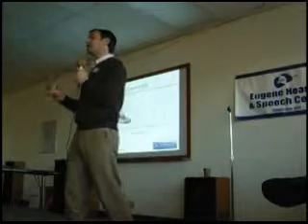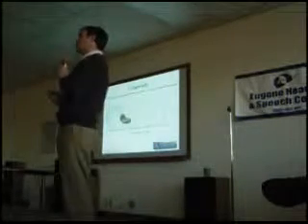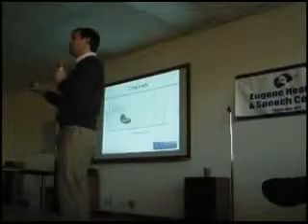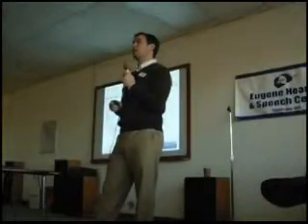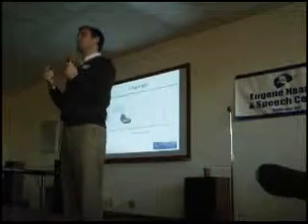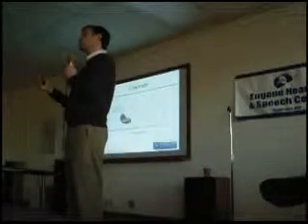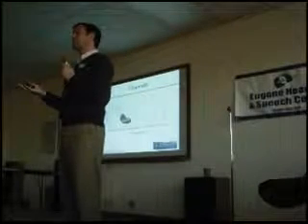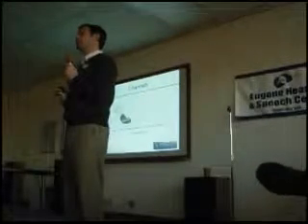Are your needs such that you have to hear in background noise situations, in which case you could say, maybe it's worth going to the hearing aid that can do the job better. And it goes back to the relationship that you have with the clinician, where you feel like the clinician is going to give you an honest answer. This goes back to the trust level. The trust has to be there.